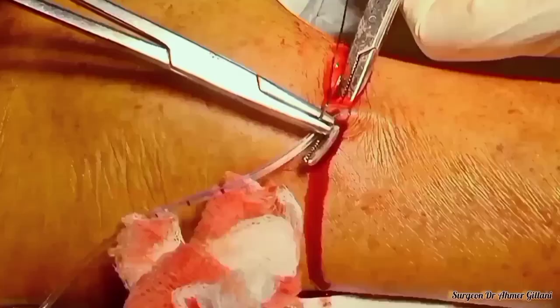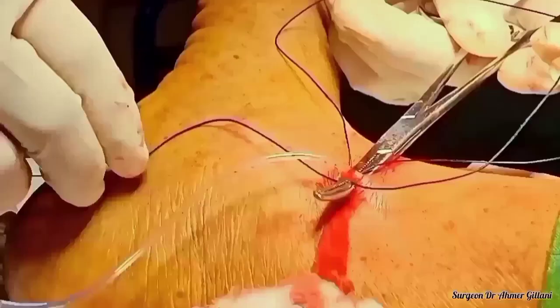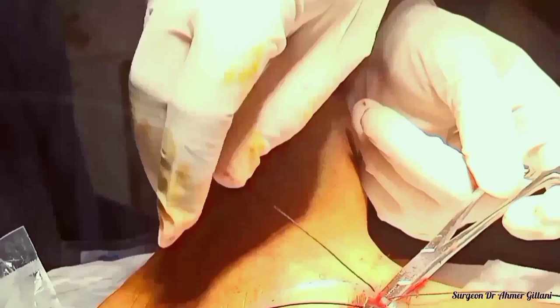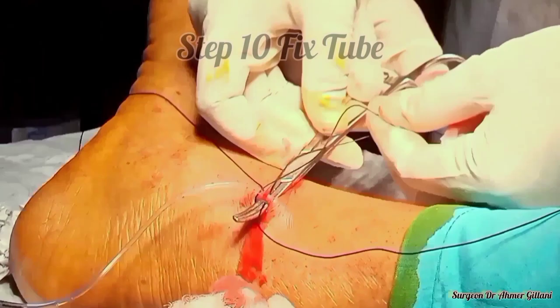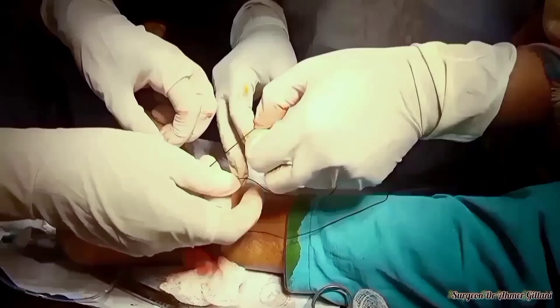Finally, at the end, we will fix this NG tube with the help of silk. First of all, we will pass from one side and then cross from the other side. We will fix the two ends — we will fix this tube just like we fix drains. Our procedure is almost completed.